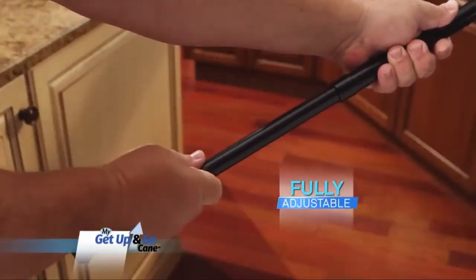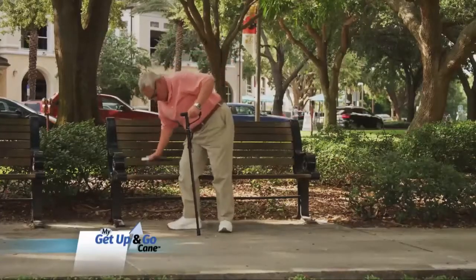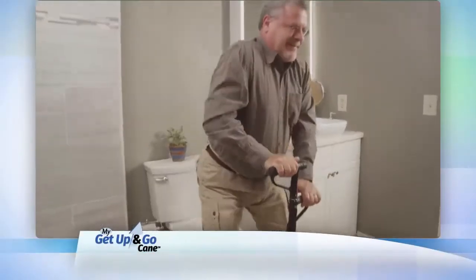My Get Up and Go Cane is fully adjustable and its soft foam handle eases impact on your hands and joints. I can get up and down without any problems and I don't feel like I'm going to fall. My Get Up and Go Cane is perfect for temporarily rehabbing or for difficult spaces like your car or the washroom, so you can enjoy the independence you deserve.